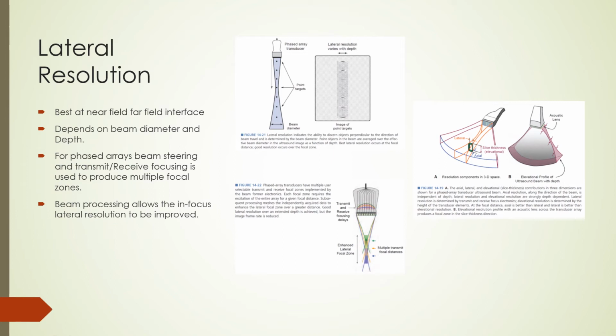For circular single transducer elements, the location of the focal zone depth depends on the diameter of the transducer and frequency or wavelength of the beam. For multi-frequency transducers shown on this slide, the lateral resolution is also best at the focal zone shown because the beam is narrowest at that location.